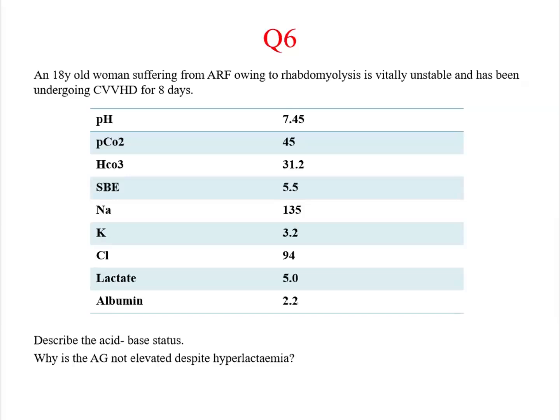I didn't get the answer for this acid-base status. Chloride responsive metabolic alkalosis with respiratory acidosis component.